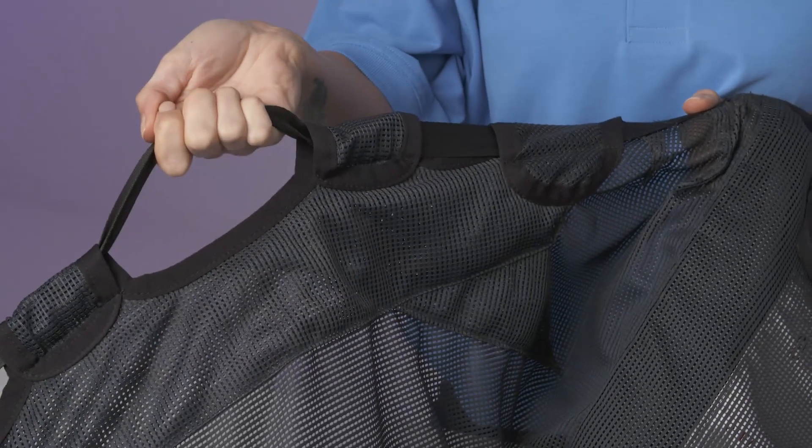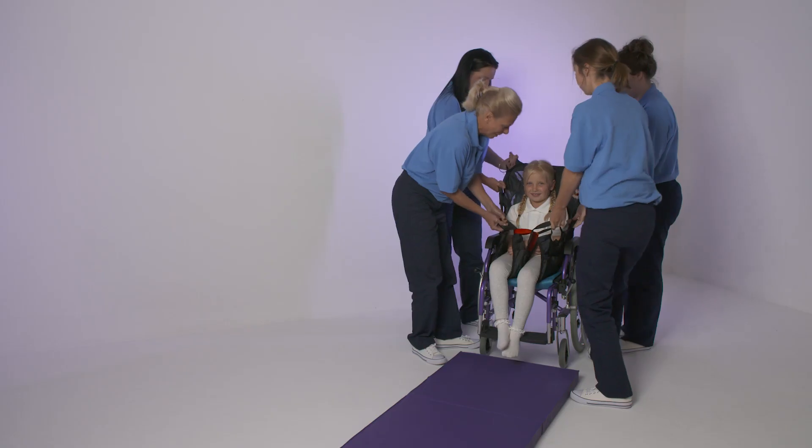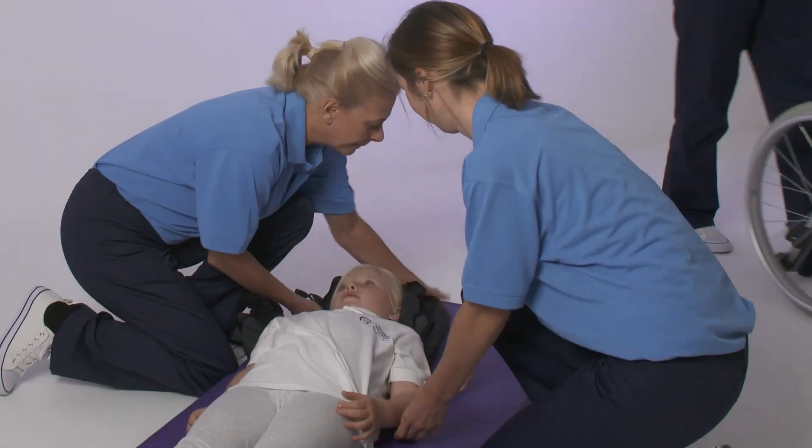Strategically placed handles are located to ensure the sling is easy to use as a two-person or four-person manual transfer aid, creating a safe and comfortable transfer for all involved.